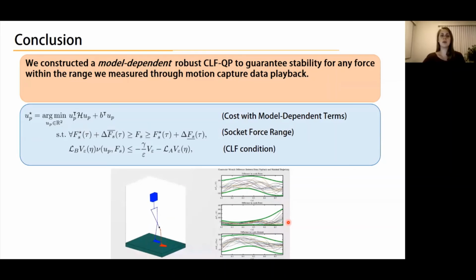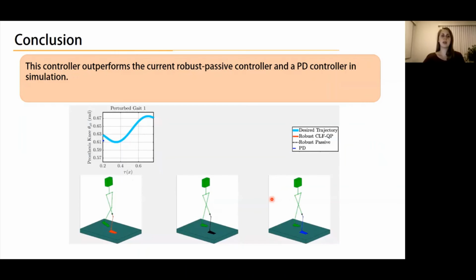In conclusion, we constructed a model-dependent, robust CLF-QP to guarantee stability for any force within the range we measured through motion capture data playback. This controller outperforms the current robust passive controller and a PD controller in simulation.